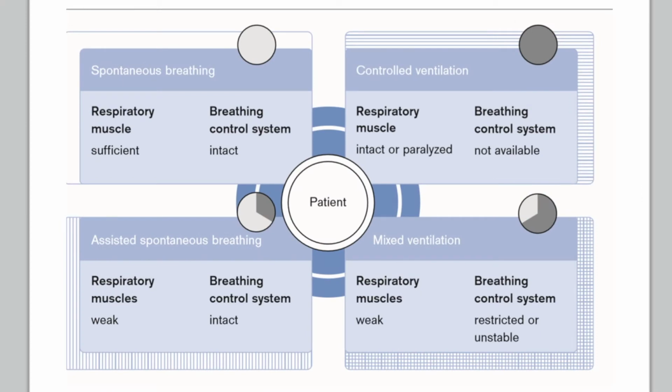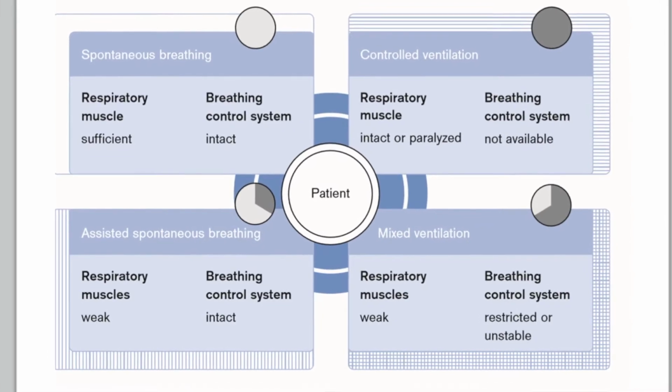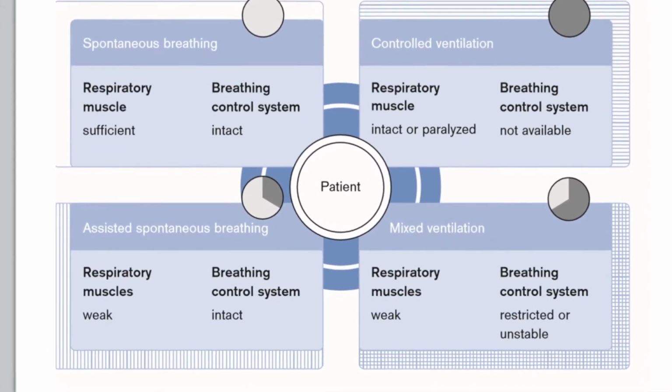As the patient improves and starts to lighten up from his drug-induced or illness-induced sleep or stupor, what you'll find is that the patient then can decide when he wants to breathe for himself. And because of that, he will then be switched to some sort of spontaneous mode.